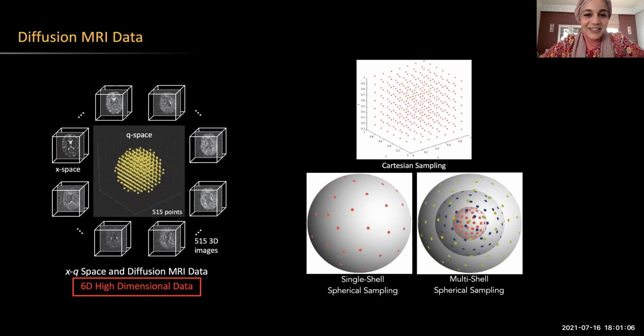I think it's getting much clearer. So basically, it's a local representation of your data that is spherical, and the other one is Cartesian. These are two different representations of the same sample. But you combine both of them because they capture two different properties of your sample. That's a simple way to put it, maybe.